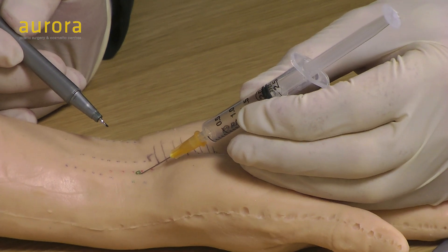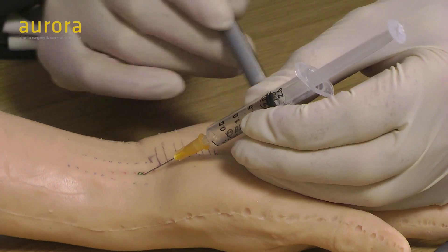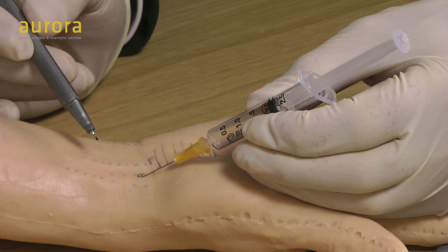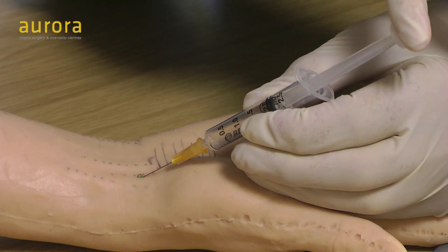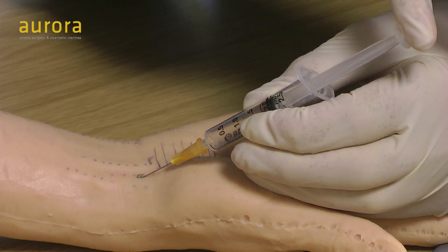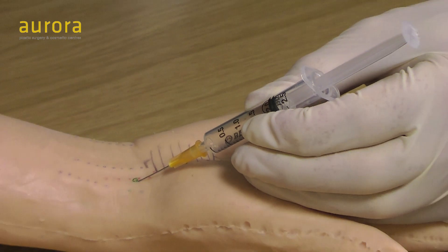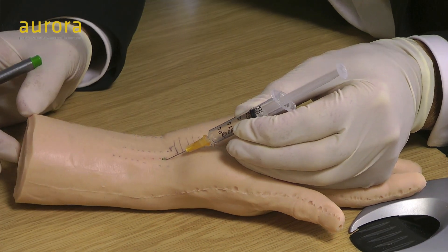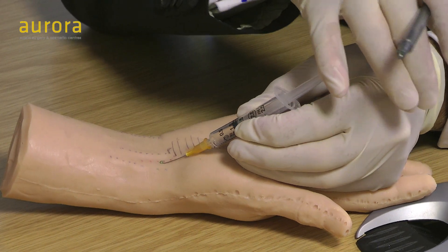Pop through the skin and then you feel the next layer, which is under the fascia of the forearm. If you get any pain going up the fingers or any twitching in the fingers, it's likely you've hit the nerve — so pull out. But as you pop through, this fluid should go in really, really easily. If there's any resistance, you're at the wrong level. It's a tunnel with a potential space — the fluid should go in easily. Make sure there's no twitching, no pain, then inject the fluid nice and gently.